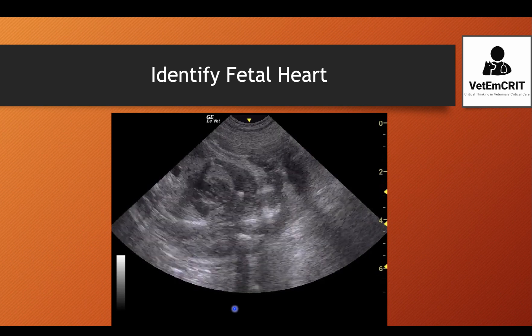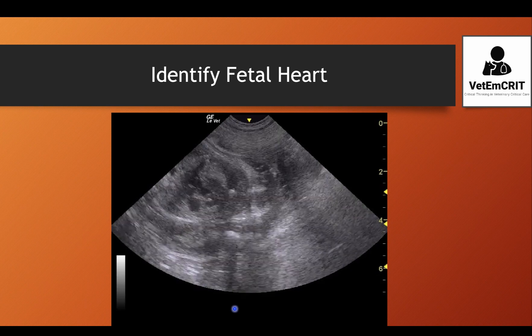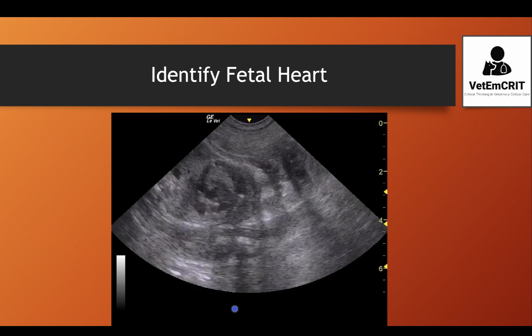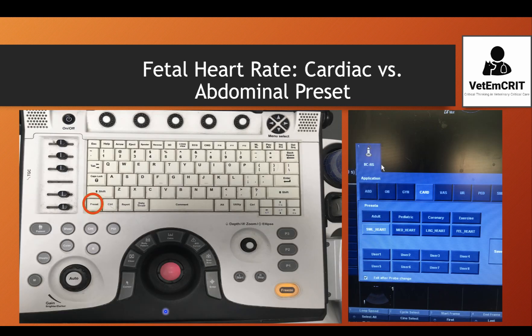Therefore, the most accurate way would be to use M-mode, which I'm going to teach you during this video. I will use the Logic E point-of-care ultrasound machine. In your practice you may have a different machine, but the majority of modern machines will have different presets that will allow you to get the fetal heart rate by using M-mode.